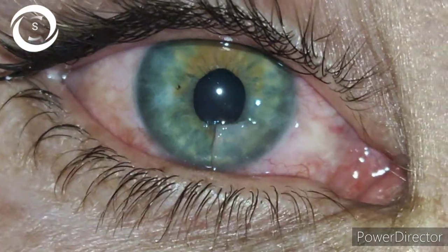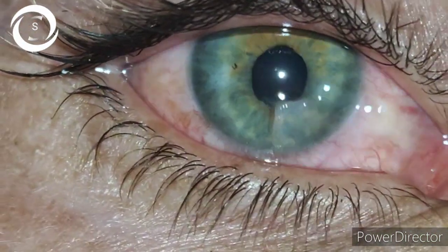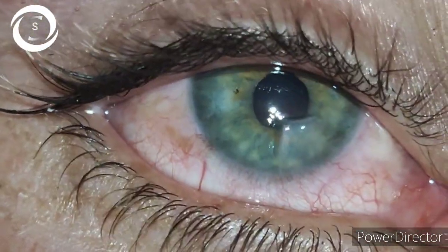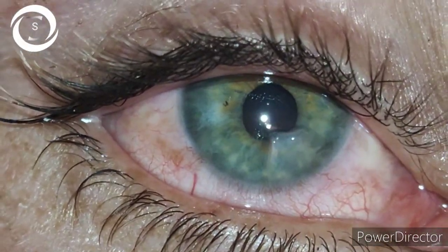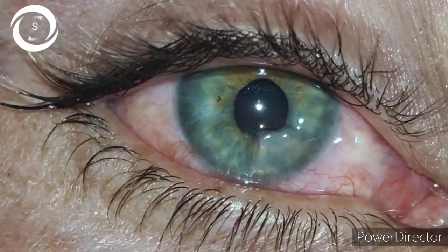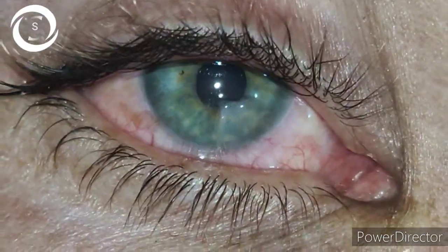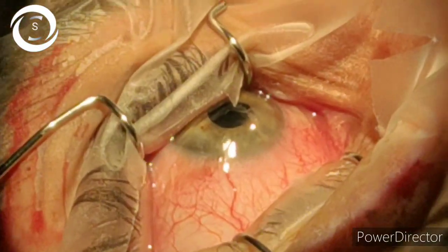Trauma is one of the most common presentations in eye clinics. Look at this 20-year-old male factory worker — a sharp metallic object has produced a full-thickness, square-shaped inferior corneal wound that needs to be repaired as soon as possible to prevent infection and sight loss.